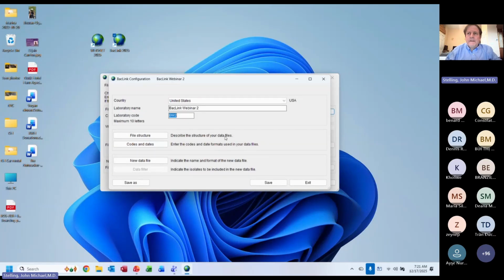And again, I think of this like a language. When you have studied languages, you study 2 main things: grammar and vocabulary. That's the same thing with data files. The grammar is the structure. How do we organize a sentence, and how do we organize the data, the rows and the columns? And when you study a language, you study vocabulary.